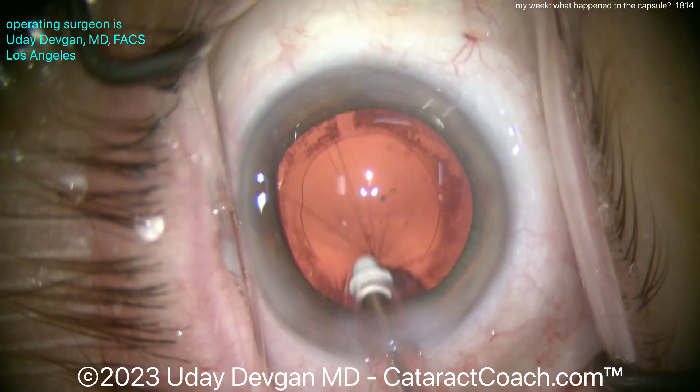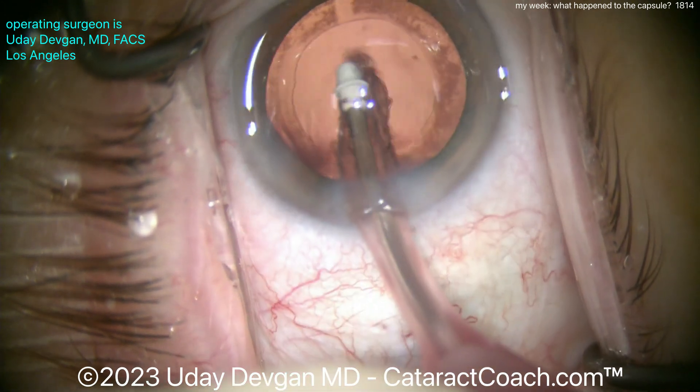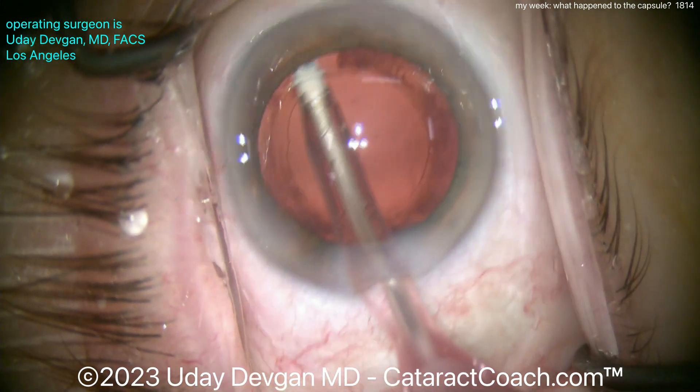Whoa, whoa, whoa — there you go, that's the posterior capsule. We let go of that pretty quickly — good reflexes there. Oh, even more grabbing. So this is a case where the posterior capsule seems to be extra floppy.